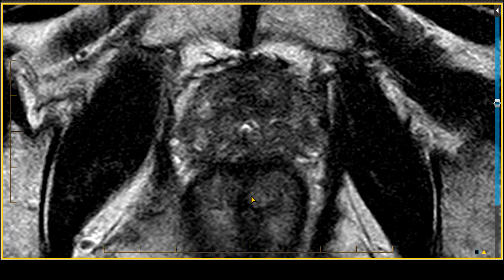The problem is that transrectal ultrasound guided biopsy under-Gleason scores prostate cancer in up to 30 to 40 percent of cases. An MRI was obtained in this patient because the PSA was going up very rapidly and had recently reached a level of 6.0. The clinician's concern was that the patient had higher Gleason score prostate cancer than had been previously detected with just the transrectal ultrasound guided biopsy.